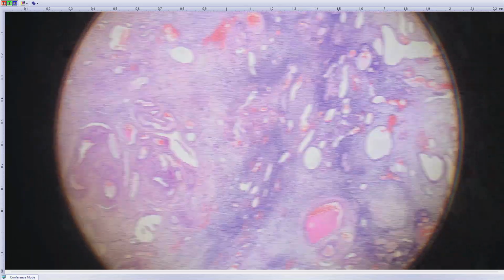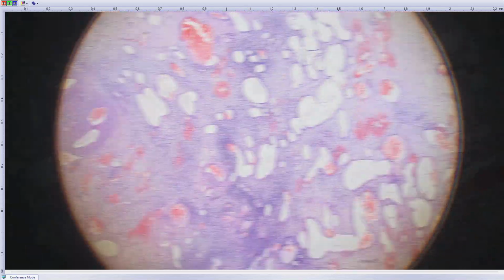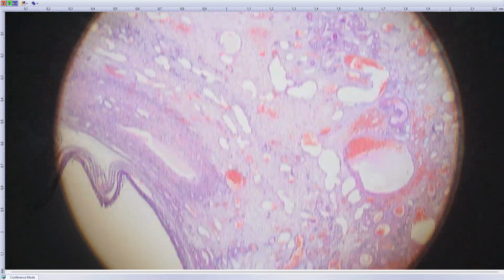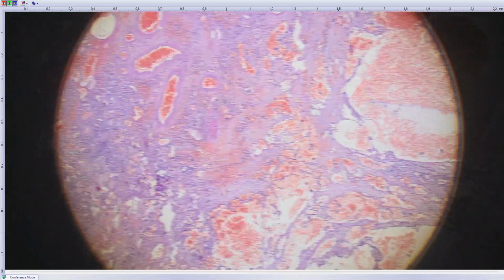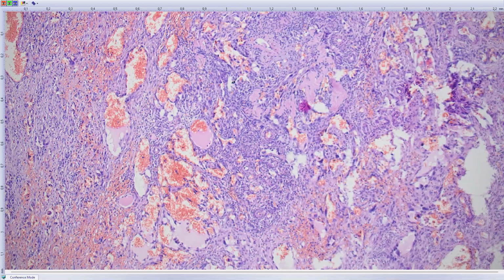I'm showing you the following biopsy, which was this year. It was sent to us as a consult, and here we see the left ovary. So in the right ovary there was a mixed germ cell tumor, and in the left ovary is this, this kind of malignant proliferation.